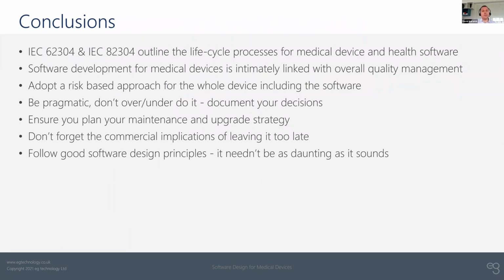So before we move on to any questions really from anybody that's listening, just a quick summary of the conclusions. There's considerable overlap between the 62304 and 82304 standards.